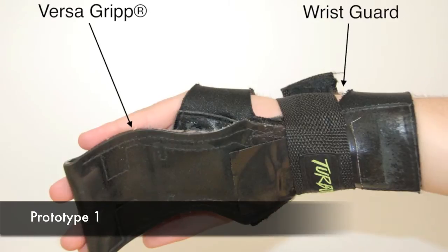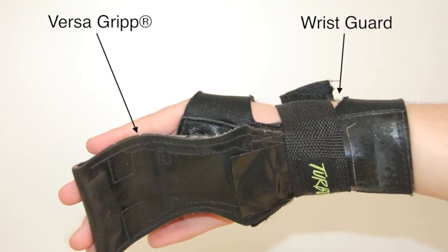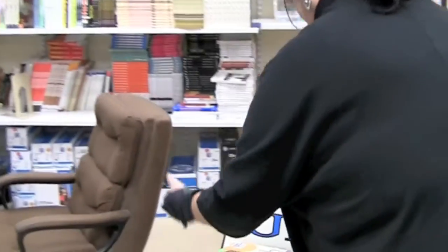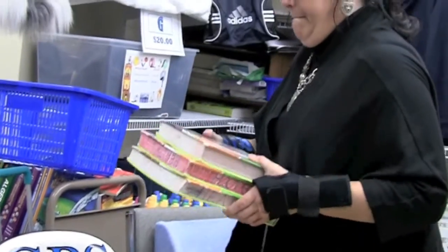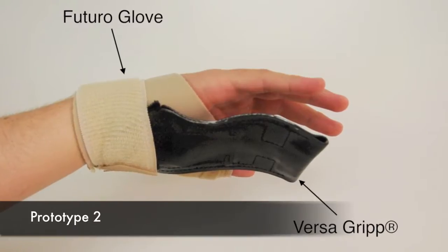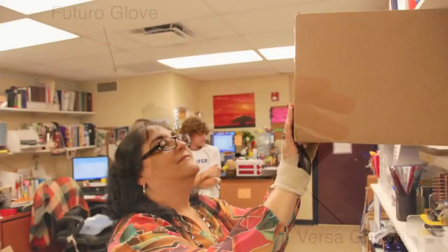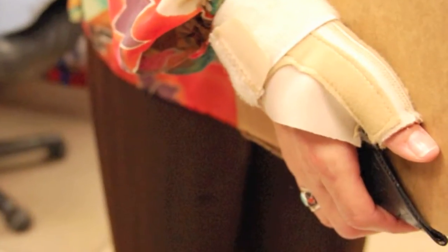The team used the ideas behind existing technologies to develop Prototype 1, which combined a wrist guard with a Versa Grip, used by weightlifters to prevent wrist injury. Although the wrist guard stabilized Lori's wrist, it inhibited her ability to lift due to its bulkiness. We went back to the drawing board and decided to use a smaller Futuro glove with the Versa Grip attached at the end.